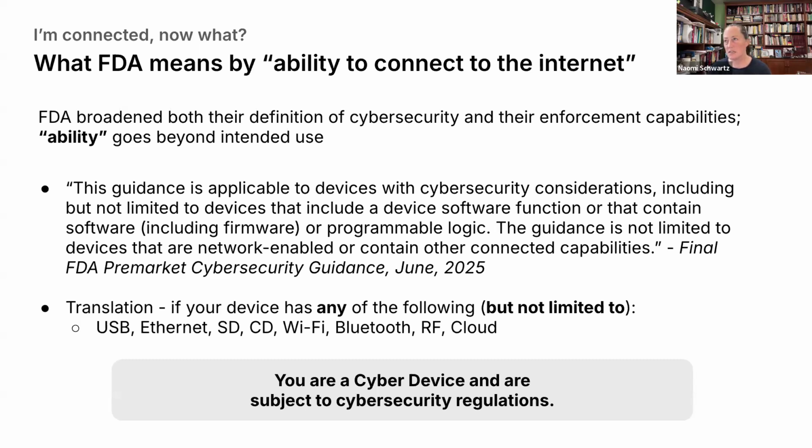The guidance is very specific about what it applies to. So for cybersecurity considerations, if you've got this software, including firmware or programmable logic, you have to take the guidance into account. It's not just limited to devices that are network enabled or contain other connected capabilities. Translation, if you have a USB port, an SD port, a CD drive, Wi-Fi, Bluetooth, RF, cloud connection, Ethernet, you are a connected device. Just don't tell people, well, the USB port's only intended for service, so it's not connected. It is in fact connected, and FDA will expect the entire eSTAR section to be filled in.